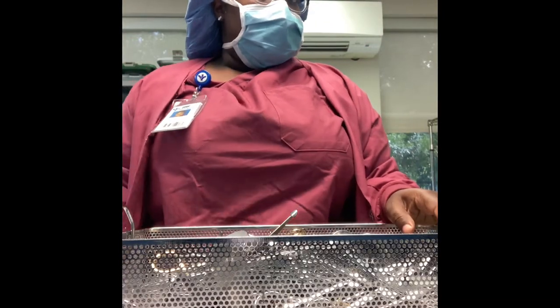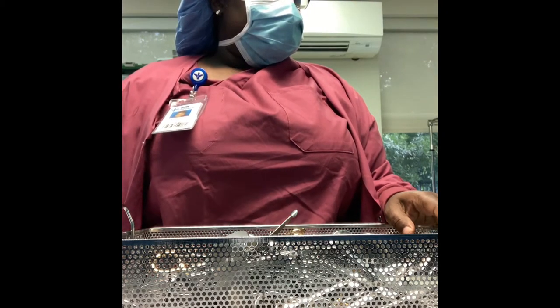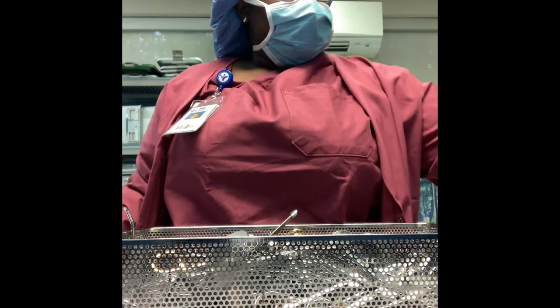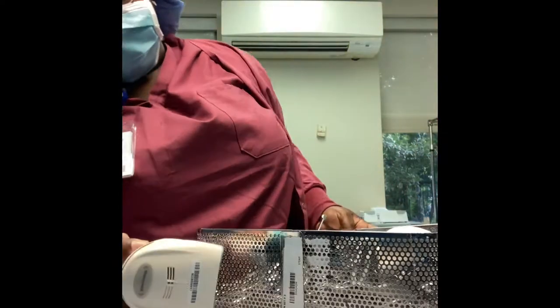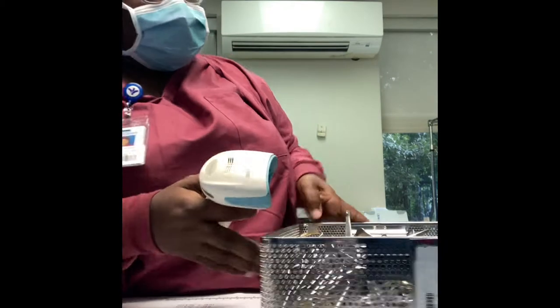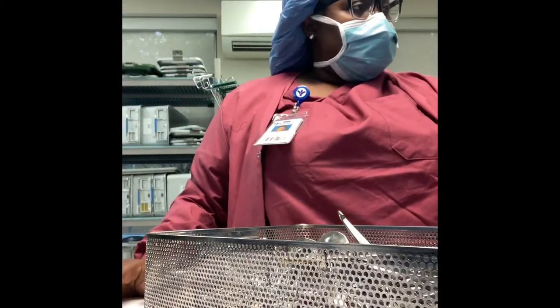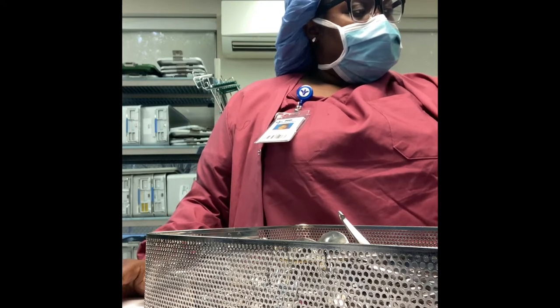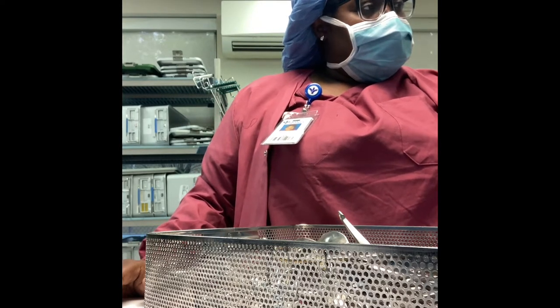What's up guys, so today I'm going to show you how I assemble a tray. Right now I'm basically just checking in the tray on the computer. At our location all we have to do is scan it and then we press assemble on screen, and then we begin to assemble the tray.